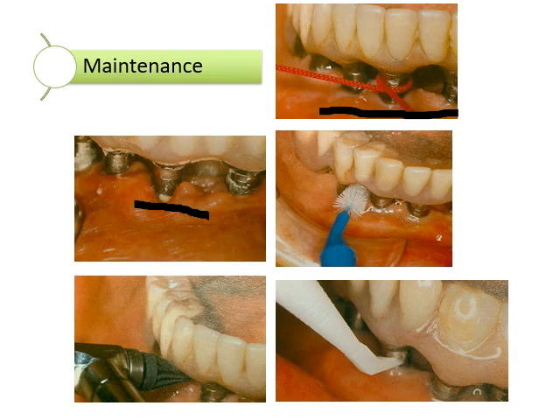And then right here on this slide is just showing you a little plastic curette. And you can definitely get in there and pick off your plaque and calculus with that. The proxy brush in the middle is blue, and if you notice that it's plastic on the inside, so you don't have to worry about it scratching the implant fixture itself because it doesn't have steel wire coming out of it, so it's plastic there. So if you have implant proxy brushes, great, use those. So these are all acceptable ways to clean around an implant.